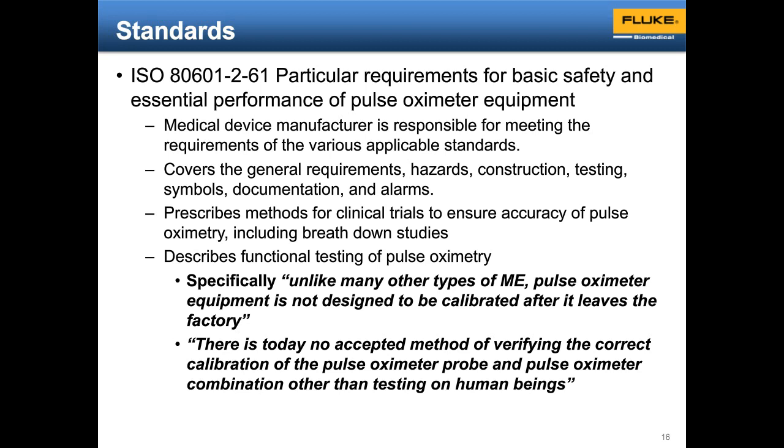But very specifically, quote, "unlike many other types of medical equipment, pulse oximeter equipment is not designed to be calibrated after it leaves the factory. Secondly, there is today no accepted method of verifying the correct calibration of pulse oximeter probe and pulse oximeter combination other than testing on human beings." So this is very important from the standard: we do not have specific calibration methods other than what's in the factory.